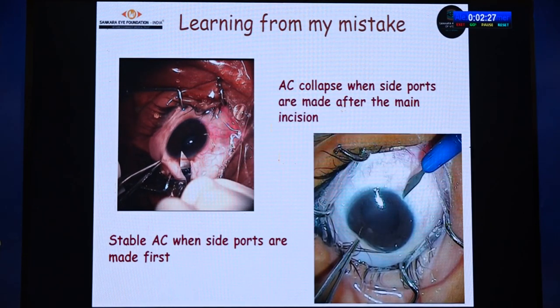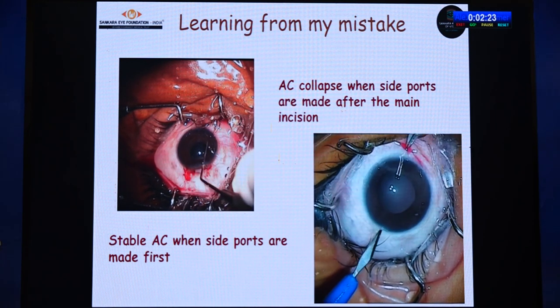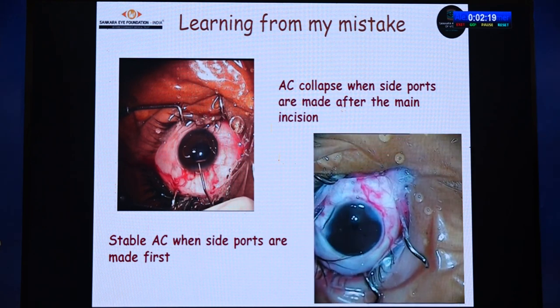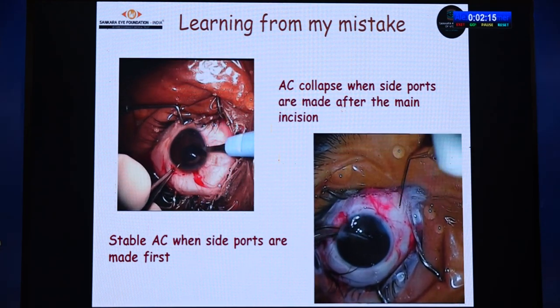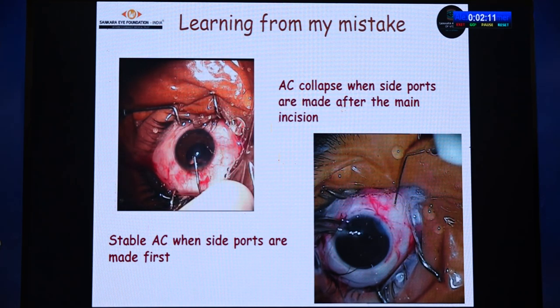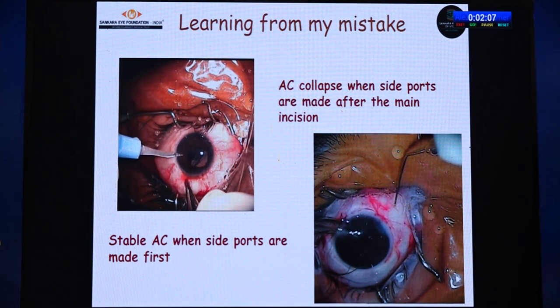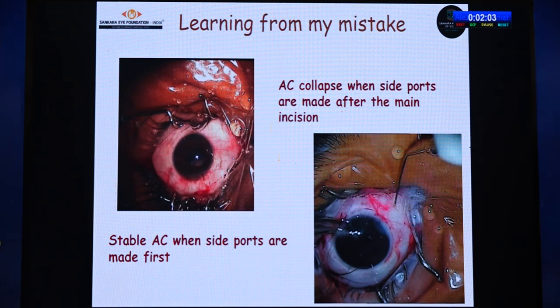As you can see here, when I do my side port first before the main entry, the AC is more stable. In the first video — recorded 10 years ago — the main port was done first, and you can see how the eyeball collapses when trying to create the side port afterward. That was my first mistake I learned from. From then on, I always do my side ports first.